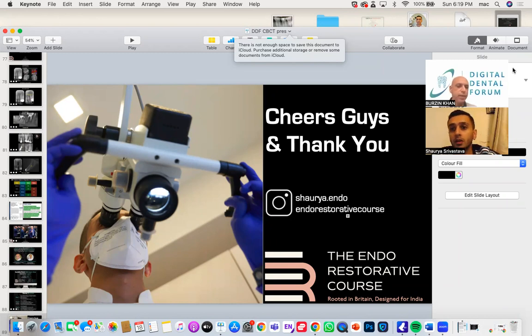Yeah, also, I guess with most of these centers, it's not a clinician who's giving the report, and it's more likely a technician who's doing it. Exactly. You also mentioned radiology not being conclusive with cystic diagnosis. Are there any other things that you would look for, or how do you diagnose a cystic lesion? You can't diagnose cystic. The only way is to excise it, send it for a biopsy, and get a histology report.